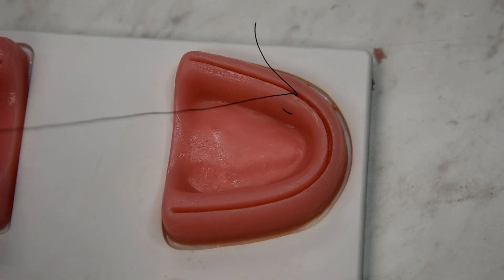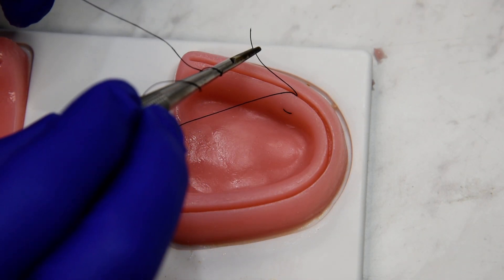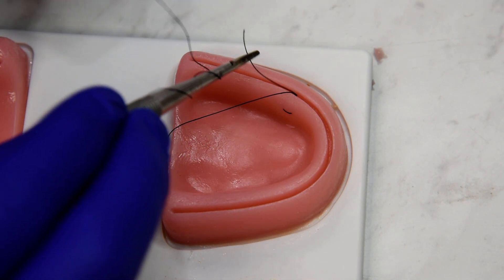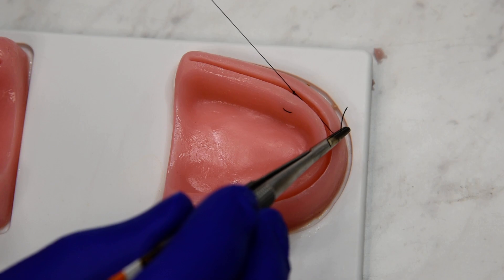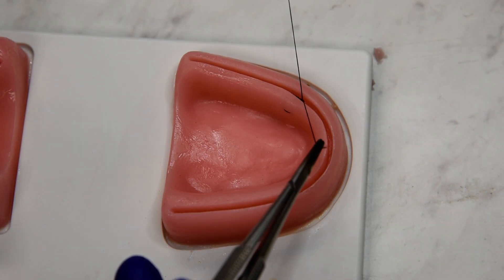So to tie it off, tie it off like a simple knot like you normally would, and this suture, besides that little loop on the palate, ends up being completely underneath the flap.